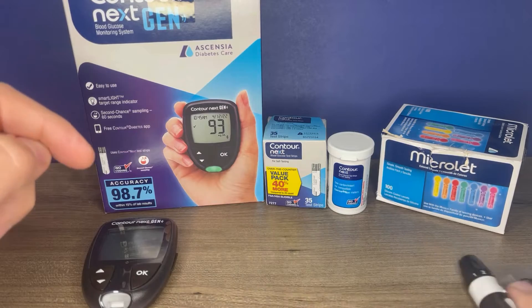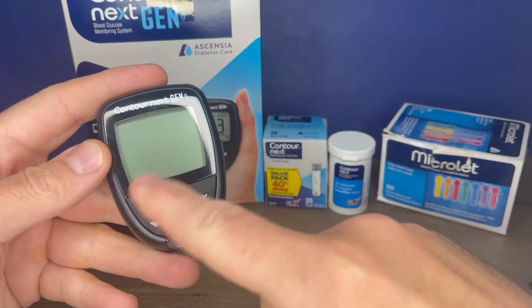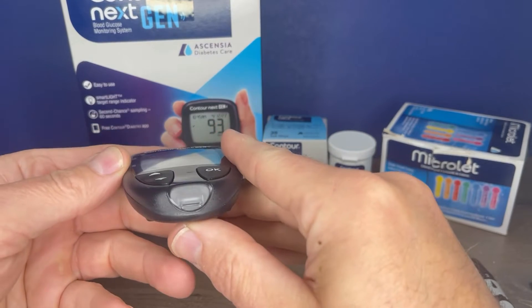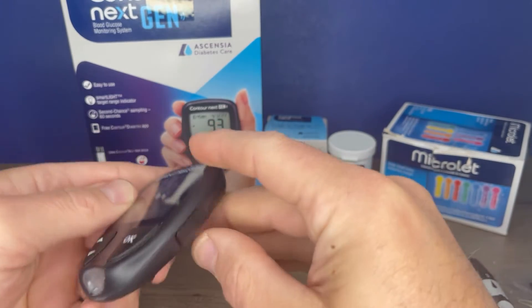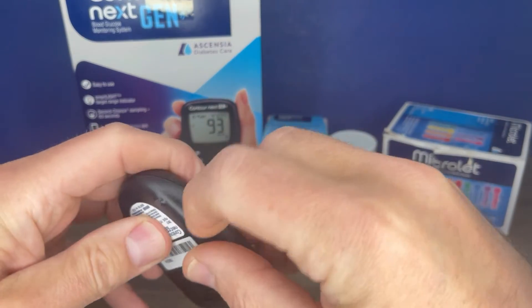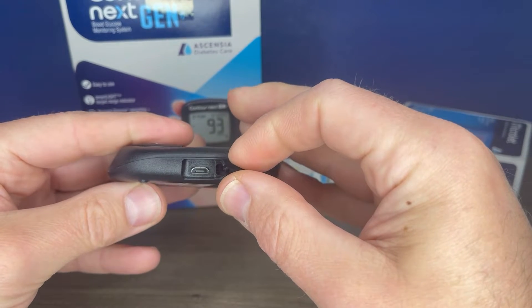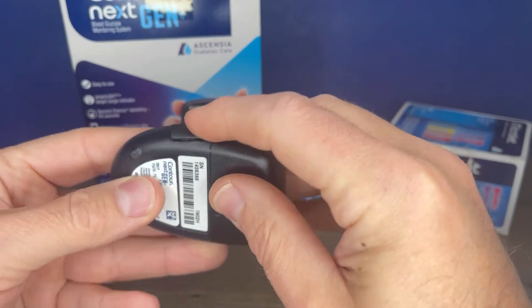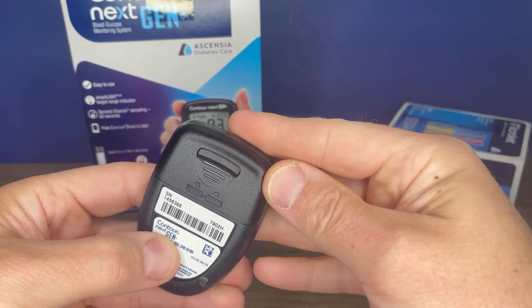Let's take a look at the meter first. On the front of the meter, there are three buttons: the up and down buttons as well as the OK button. There is also your test strip port, which is where the test strip is inserted into the meter. It does have a USB port on the side of the meter that will not recharge the battery. That is used to connect to a computer — if you have the proper software downloaded, you can download your readings into the computer. And then there is a battery door.